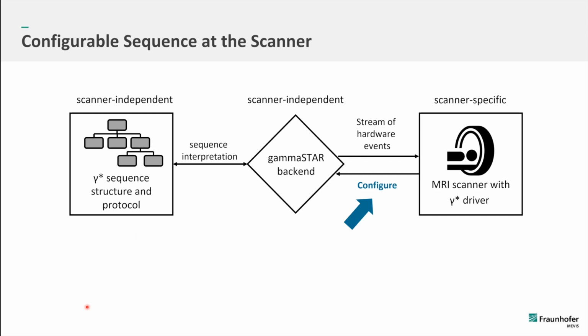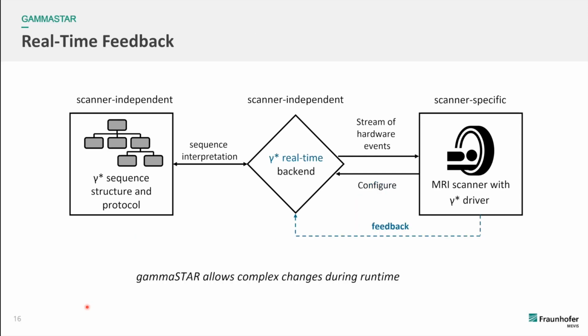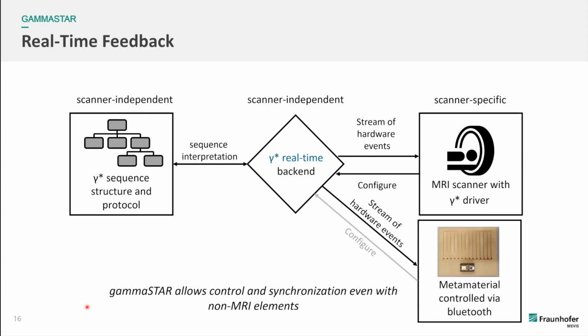And this GammaStar backend can be extended easily with additional time tracks, which allow us to control metamaterials as well via Bluetooth. So we are synchronizing the MR part with our metamaterial using the GammaStar framework.